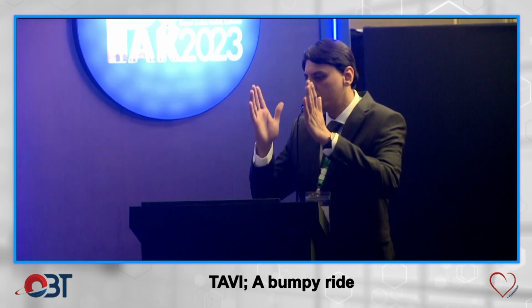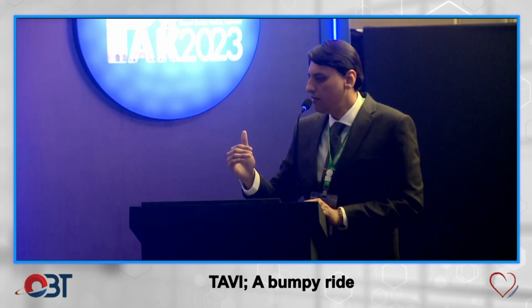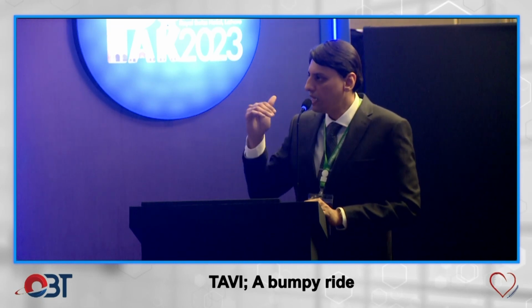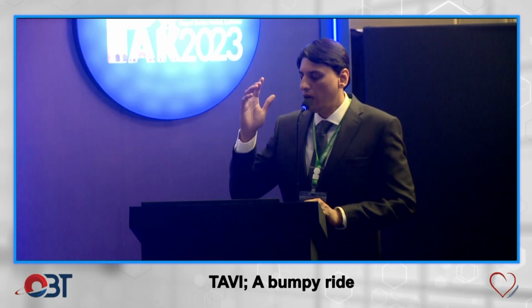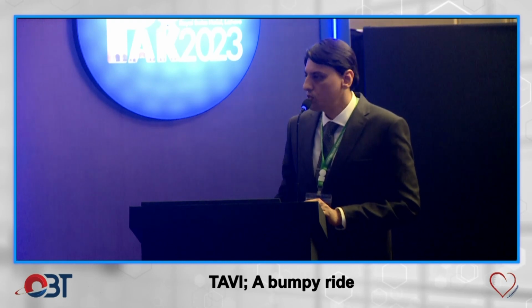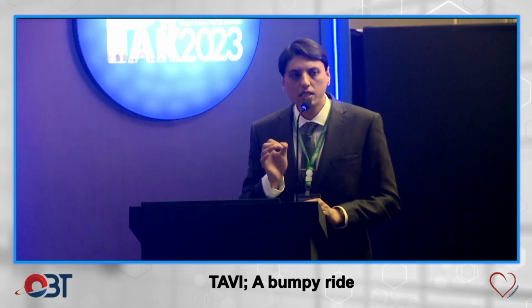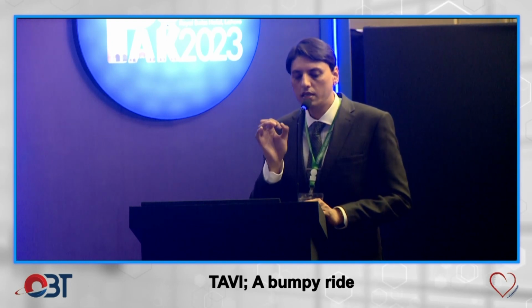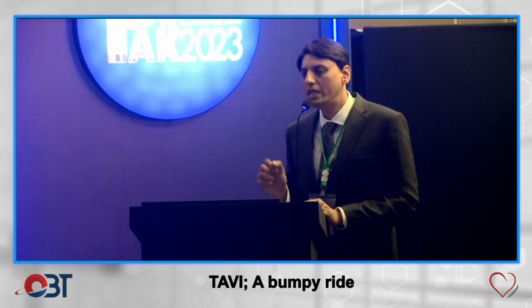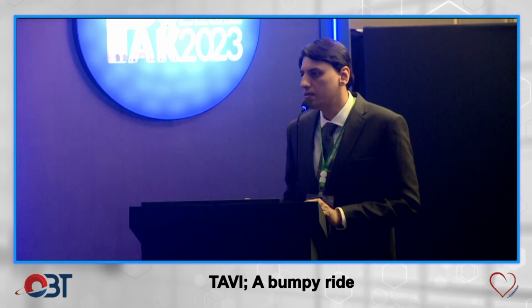Because our anatomy was tubular, our intercommissural distance was the same, our valve annulus was almost the same. The perimeter was 82, it was well under a 34 mm valve, and the annulus was more than 26. So in sizing, it's an important point: sizing your valve in a bicuspid anatomy is different as compared to a trileaflet valve. We have to consider these things.